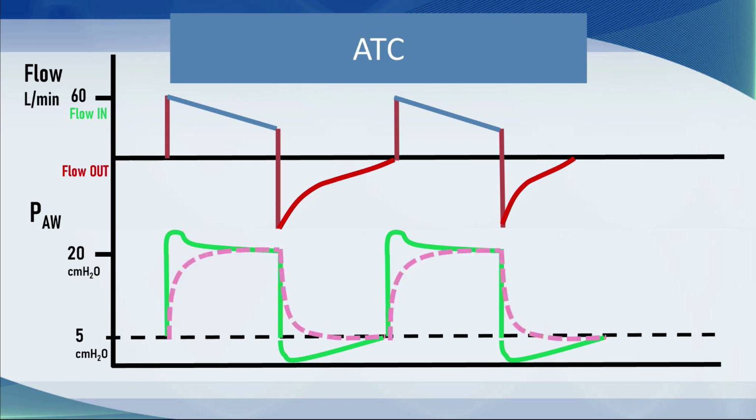Importantly, the alveolar pressure is kept constant, and it does not mirror the upward and downward humps on the pressure waveform that are associated with automatic tube compensation. So even though the waveform looks a little bit ugly, what's happening inside the lungs is very reassuring.